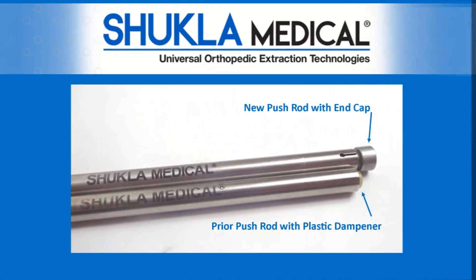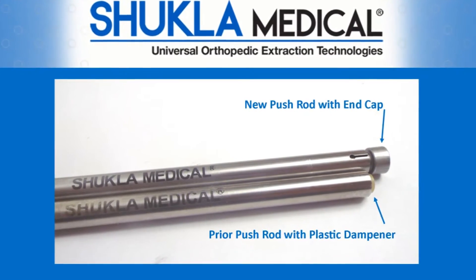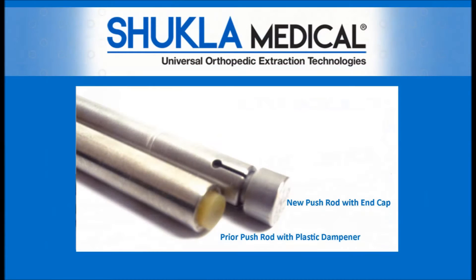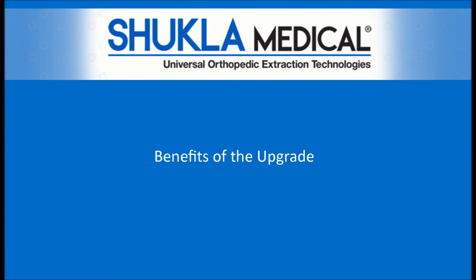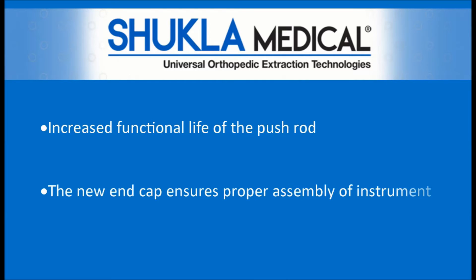The upgraded pushrod now conceals the plastic dampener internally. By adding an end cap, we've ensured the plastic dampener will not get damaged and will provide the same feel and functionality. These updates present a pair of benefits: an increased functional life of the pushrod, and the new end cap ensures proper assembly of the instrument.